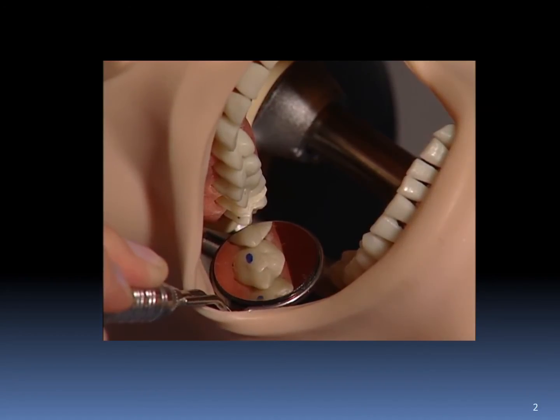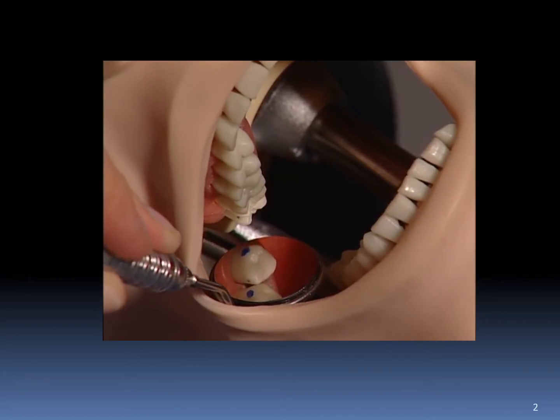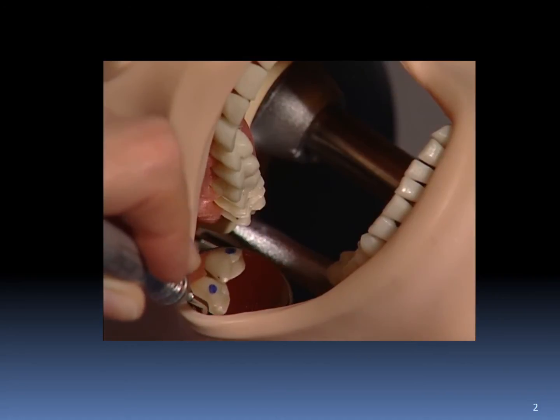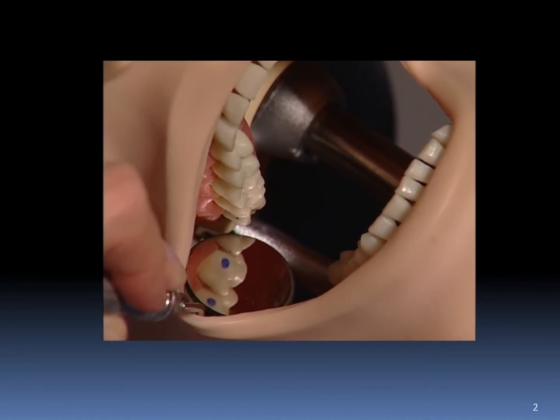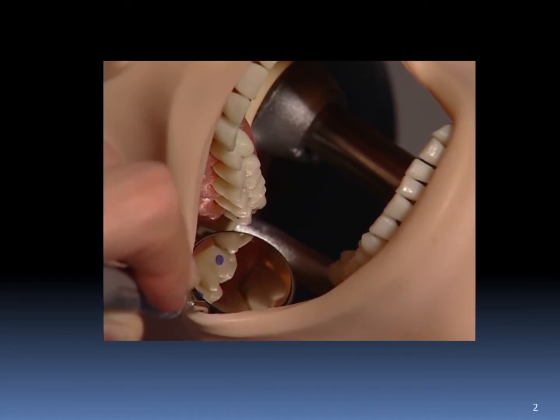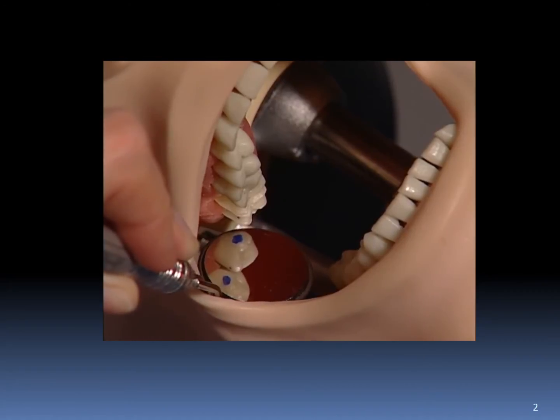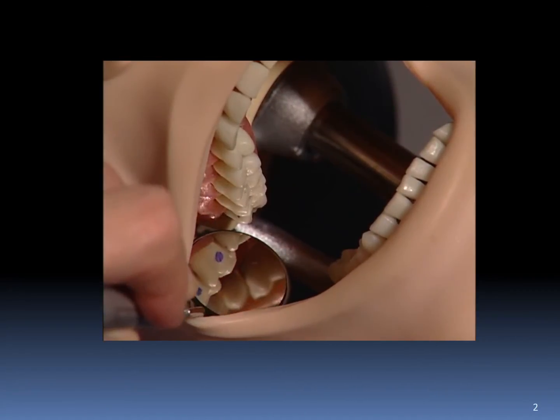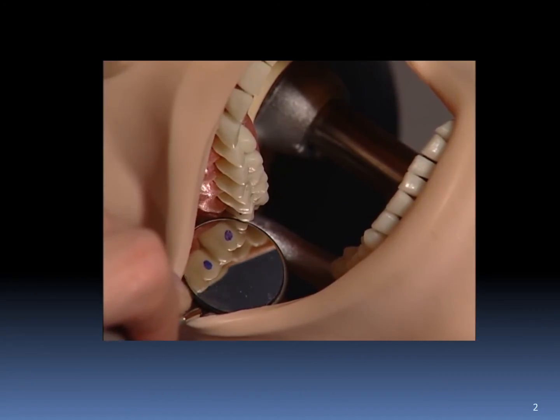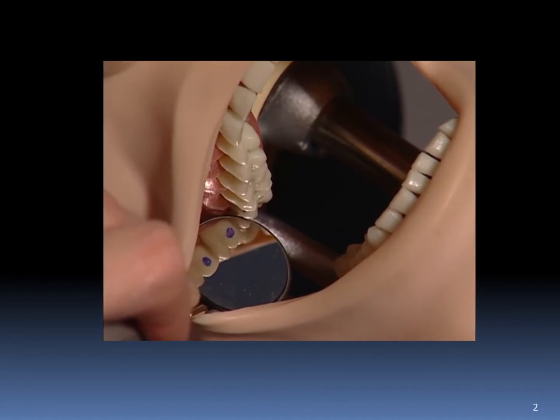Did you notice that the clinician rotates the position of the mirror head in order to view the distal surface of the tooth? In this position, you have a clear view of the facial surface. Now, with a slight rotation of the mirror, the distal surface comes clearly into view. Remember not to maintain the mirror head in only one static position. Rotate it slightly to obtain a clear view of all 3 surfaces of the aspect.